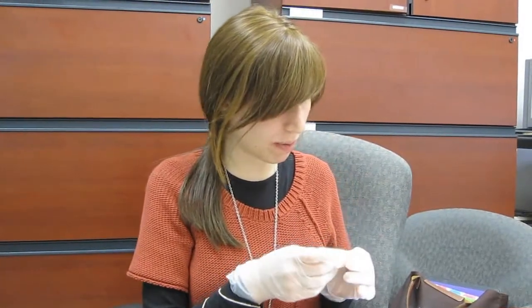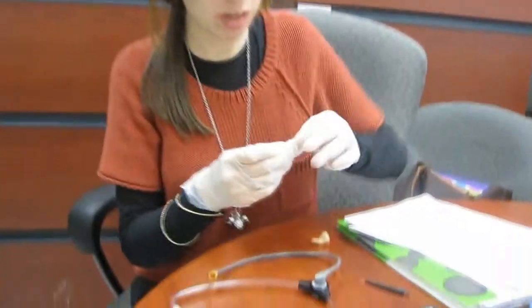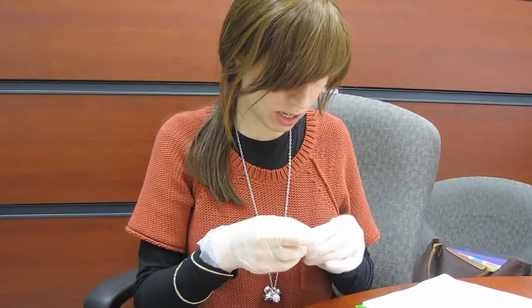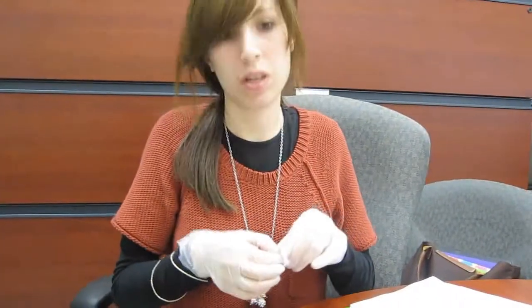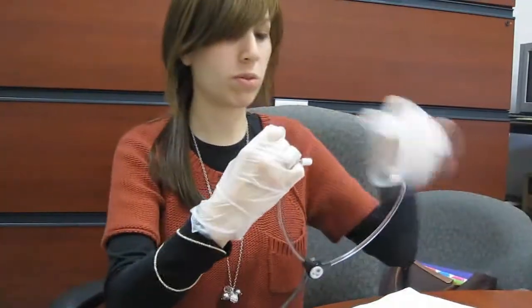The color looks good. Okay, now we're going to check the battery, and we're going to take it out and put it in the correct one, and it's working because you see that it went to the green side. Okay, now we put it back in. It's just a little bit hard to maneuver with this. Okay, and we did this before, but we do it again.